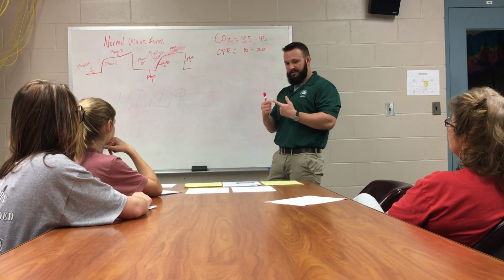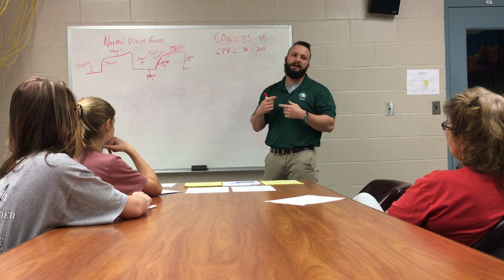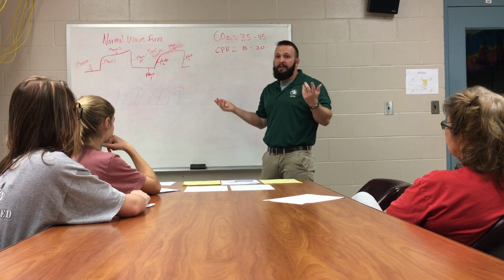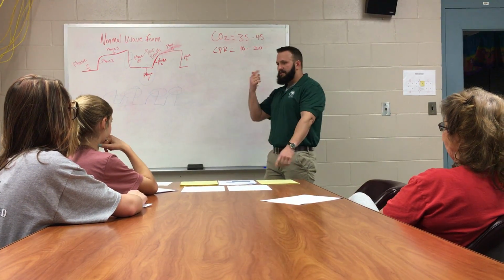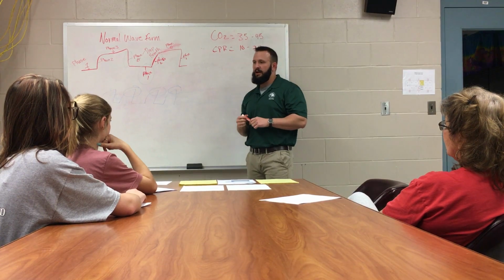Well, we have them on a pulse ox, and we would like to think that, oh, if the tube comes out, our pulse ox is going to start to go down. We're going to go from 100% down to 70. And theoretically, yeah, we will, but it's going to take a few minutes because we all know oxygen has to start from here, pump all the way through the body to come out to here. This is our longest point. So it's going to take a few minutes for that to show.